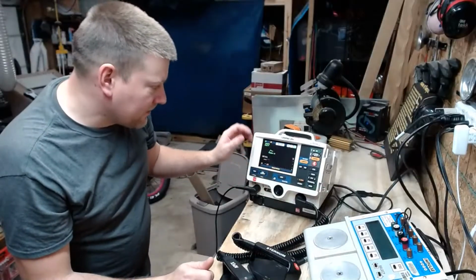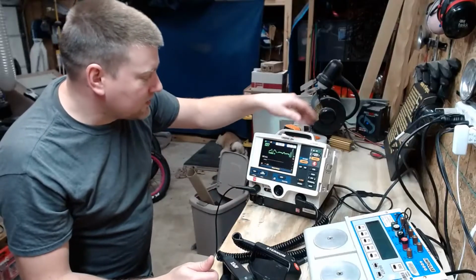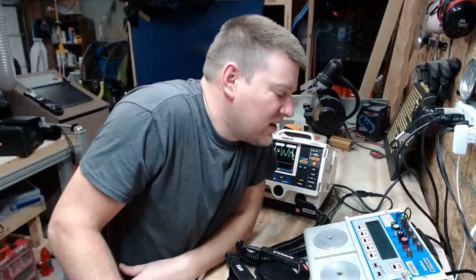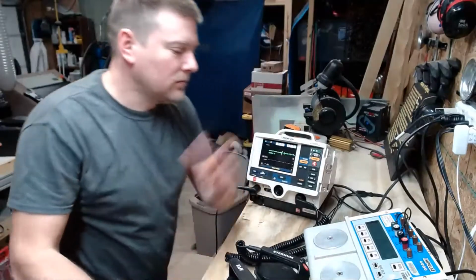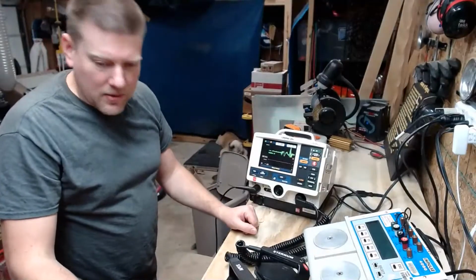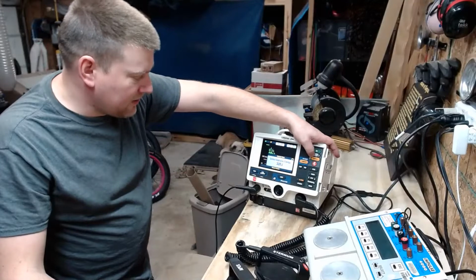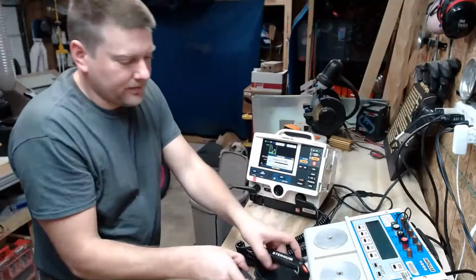So you can see. All right, so it's looking for a heart rate right now. So I discharged at 360 joules. Over here on my analyzer, it's reading 369.2 joules. That one's good. And from here, you're going to select a different energy range. So set it at 300, charge.